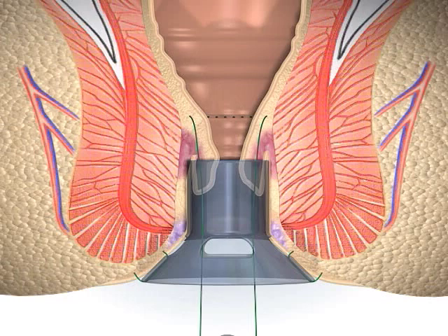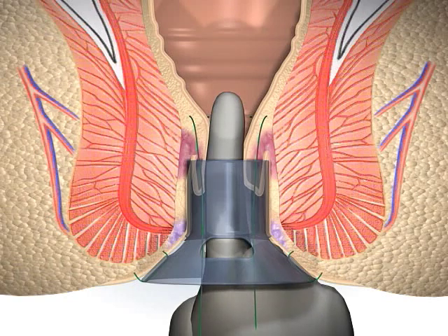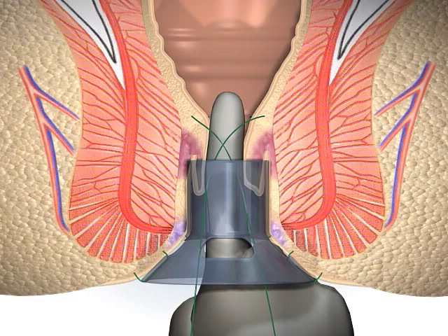A finger is placed in the anus, and the purse string is tightened to check for a uniform circumferential closing with no skips or gaps.